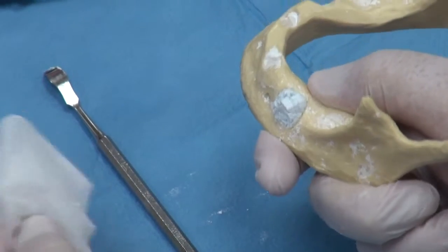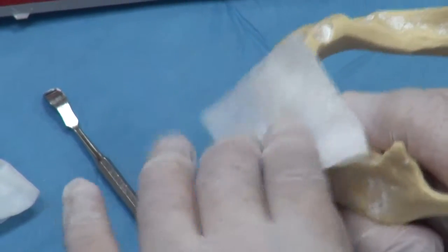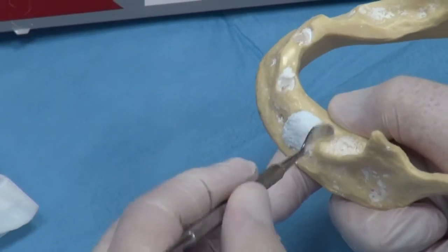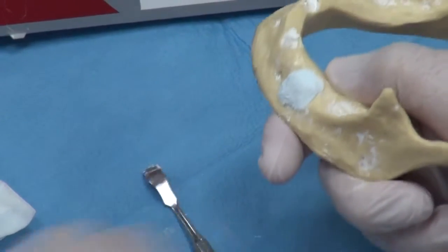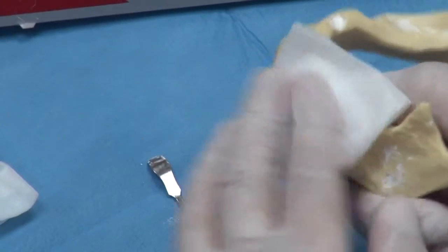We simply take a dry gauze pad and give a firm two to five second compression of the material. You might want to shape your graft a bit with a spatula, and again give a two to five second compression with the dry gauze.